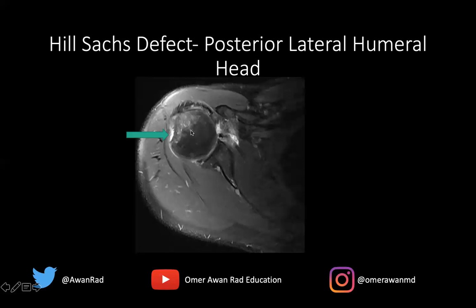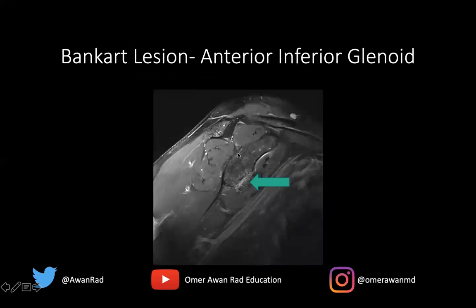This must mean there has been a prior anterior glenohumeral joint dislocation. It's not currently dislocated because the humeral head is articulating well with the glenoid — it's currently located, but we see evidence of prior dislocation. The Bankart lesion on MRI is best seen on the sagittal view — this is the Y of the scapula, with the acromion, coracoid process, and glenoid visible. The subscapularis and lung are anterior, so anterior is this side and posterior is the other.